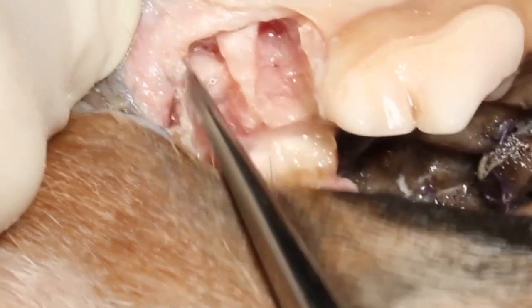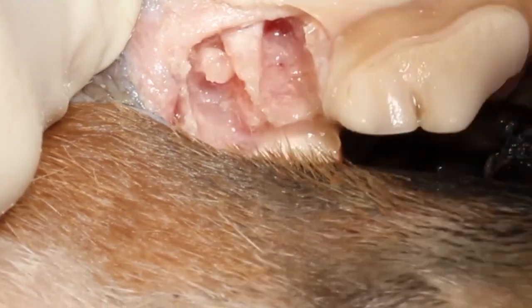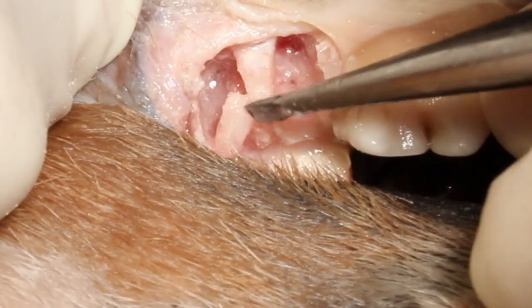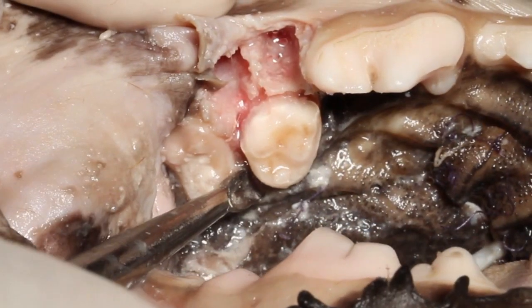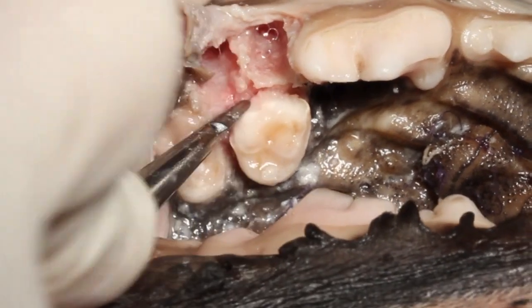Once that's done you can close surgically. You'll probably need to do some dissection both apically and caudally on that flap in order to get it to the point where you've got good exposure.